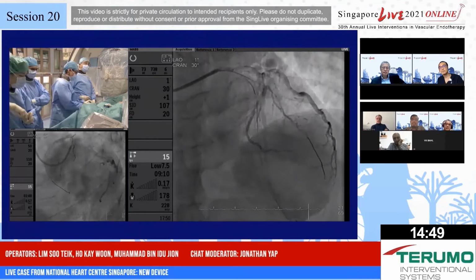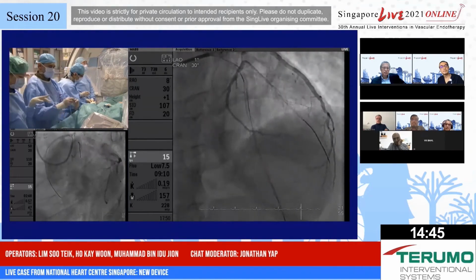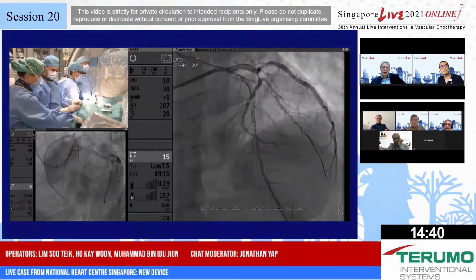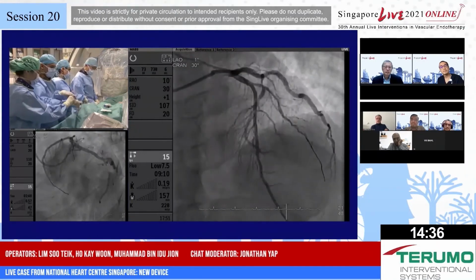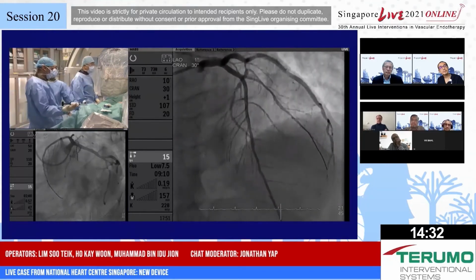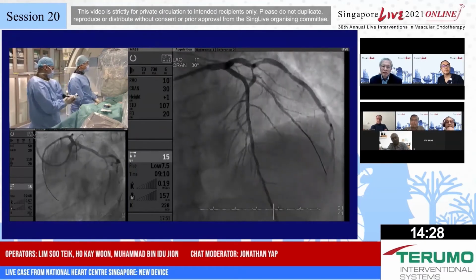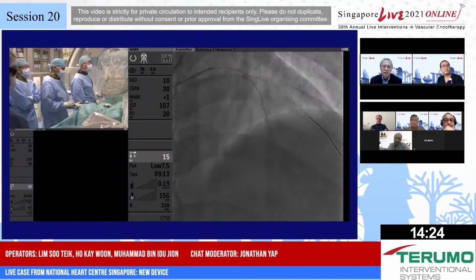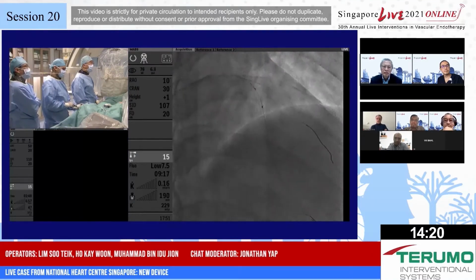We go a little bit RAO, and then prepare the short 3.5, long 8 millimeter. Yeah, NC. Let's do a prepare 3.5 for the stem, 8, boost. 3.5 stem boost. Yeah. More RAO, yeah, more RAO.